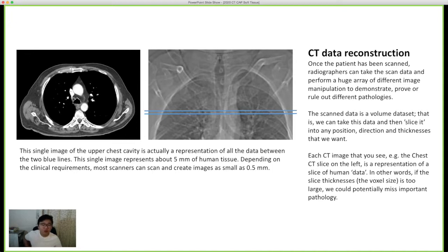But some radiographers, when you go to a CT rotation, might be very pedantic about the number of slices you send to PACS or how big your window box is. In my personal experience, I'm not as pedantic because I'm not from that generation, but the CT supervisor that I work with can be a little bit pedantic in that regard, but obviously everyone to their own. But in my personal opinion, it doesn't make a huge difference at all.